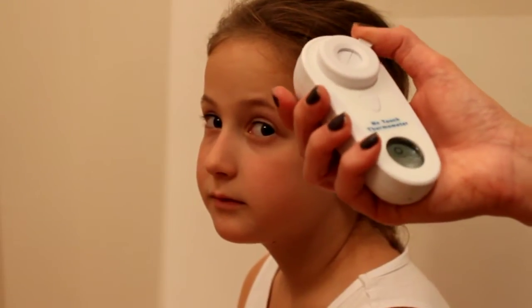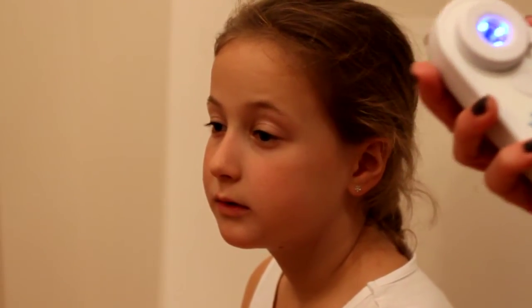Open the shutter by flicking the switch. Remove all hair and sweat from the temple region.